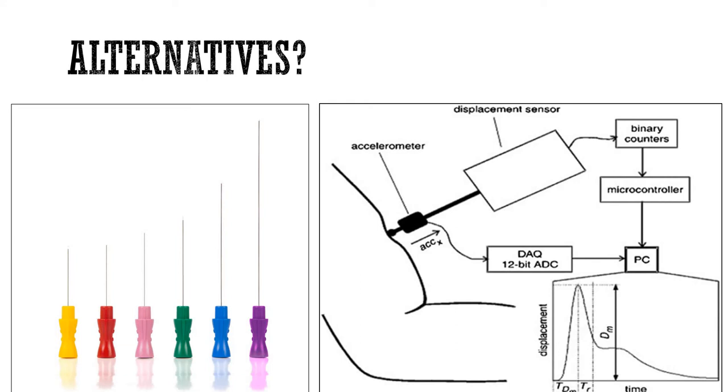underneath there, although it doesn't actually attach to your hip, it's a monoarticular muscle, is the intermedius. We can't access this muscle, so we can never get a true representation of all of the quadriceps muscles, which is a huge limitation. So how do we overcome this? Well, you could use needle electromyography. I wouldn't want to, but you could.